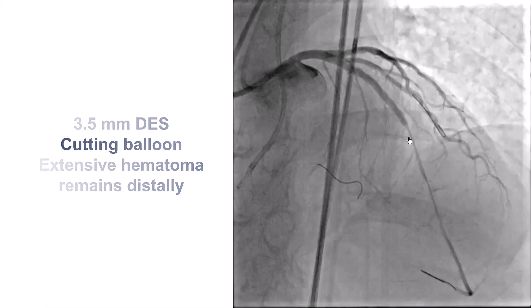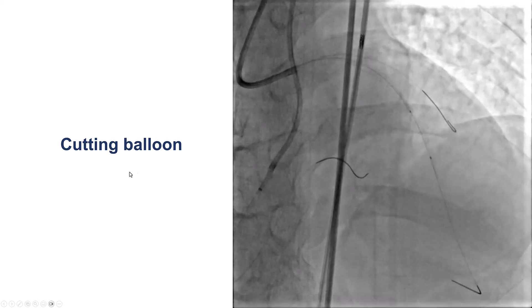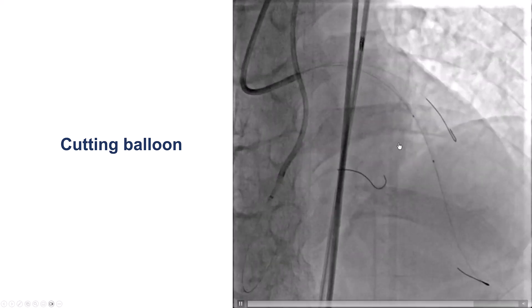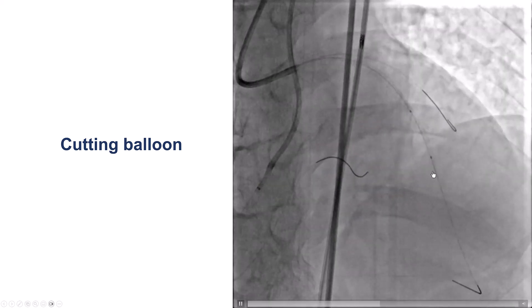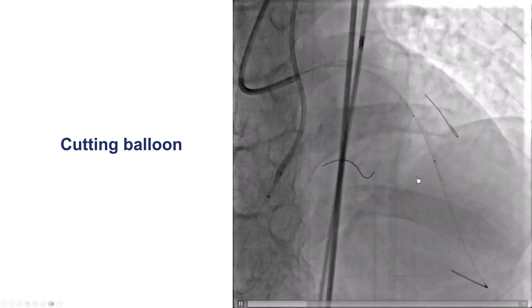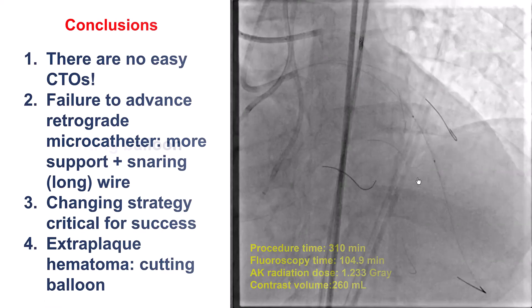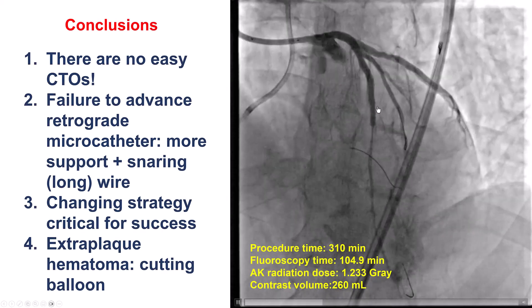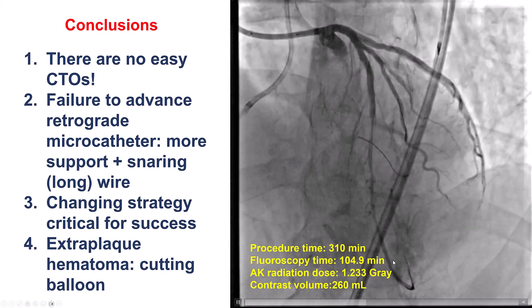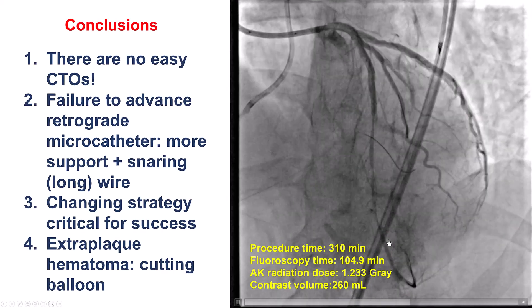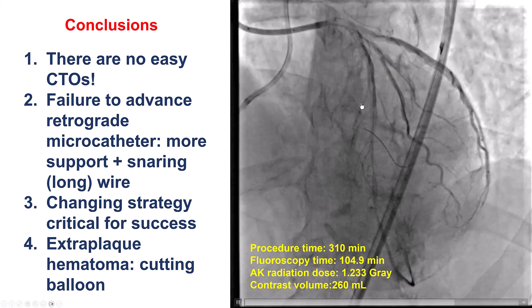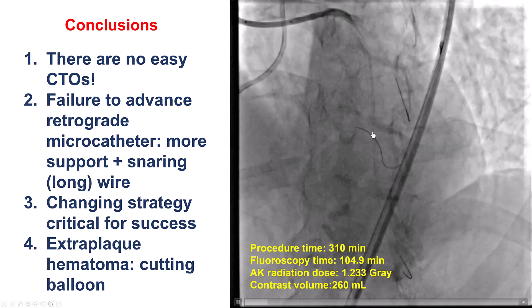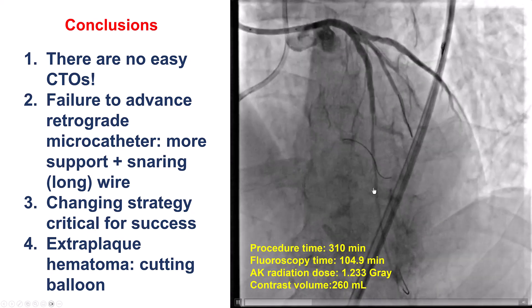For such hematomas, a cutting balloon can sometimes help decompress them. We performed inflations with the cutting balloon, and although it wasn't perfect, we did achieve antegrade flow and decided not to place any additional stents down the LAD.